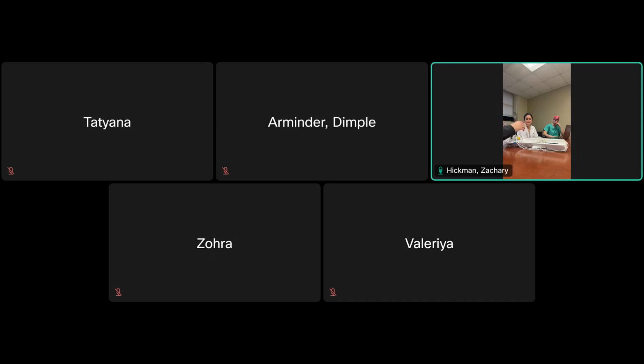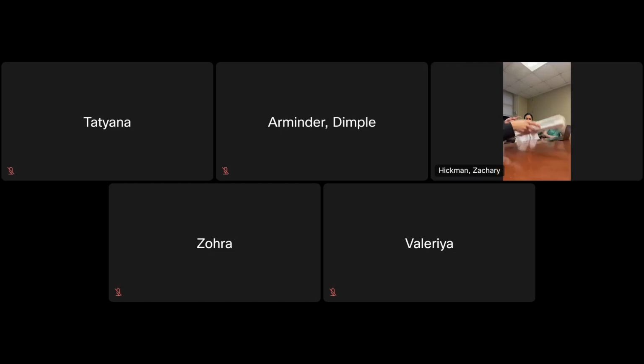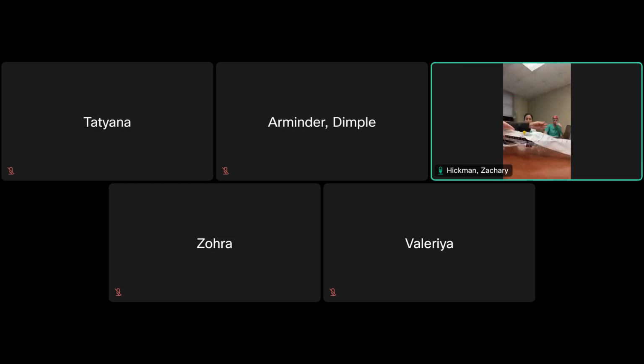Generally how it's done, we prep sterilely, we make an incision, we retract, we drill a hole, we tunnel a trocar, because this gets tunneled under the skin. So you have this part actually in the head, this part goes under the skin, and then the end of it comes out behind where the incision line is. So we'll tunnel it, then secure it, and connect it to this bag. And you close skin normally.